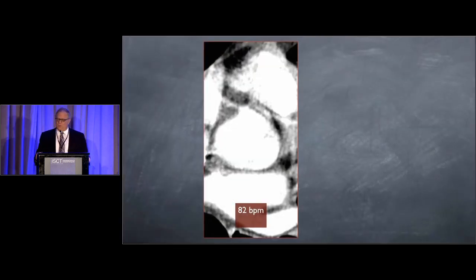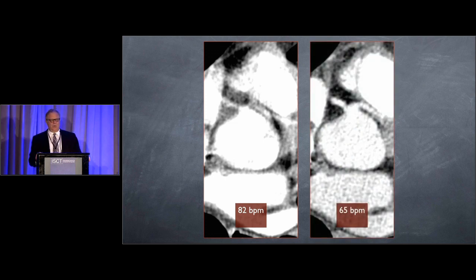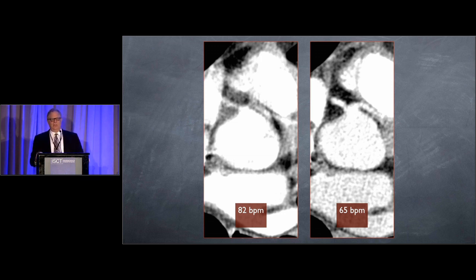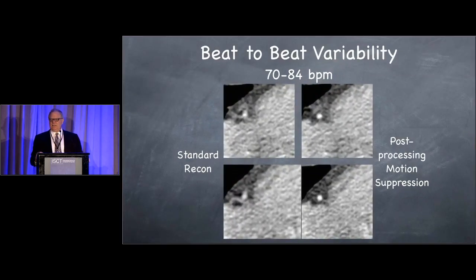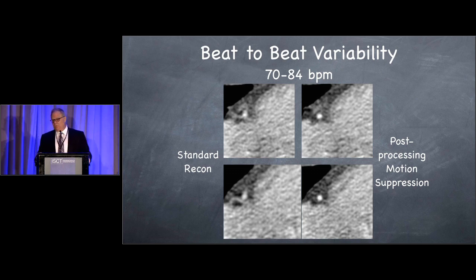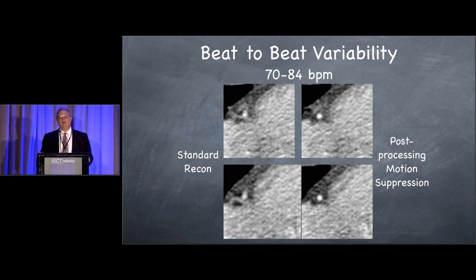Here's an example of a patient with a higher heart rate versus a patient with a lower heart rate. With a lower heart rate, given a fixed temporal resolution, we can see the anomalous origin of the left main coronary artery at 65 beats per minute, but at 82 it's just a big smudge. This is an example of the use of a post-processing algorithm to correct motion — the images of the right coronary artery demonstrate blurring, and the motion correction brings them into higher fidelity in a patient with a higher heart rate.